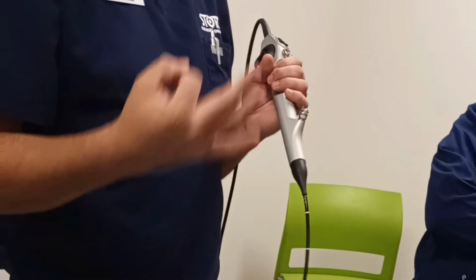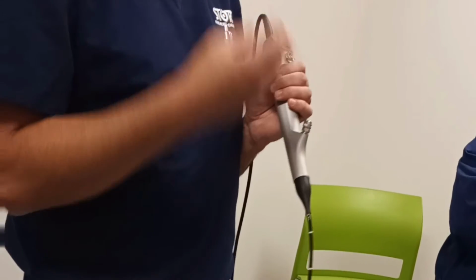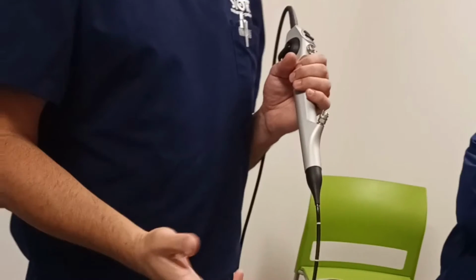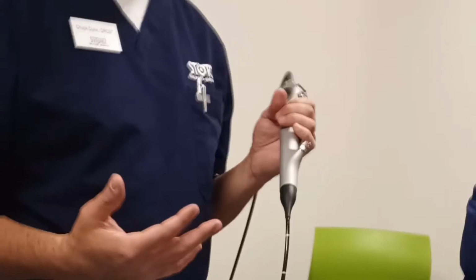So you're going to do a minimal of 3 times, but that doesn't necessarily mean you have to stop after 3 times. After your 3rd time, if you still see debris either being pushed out or pulled out, continue to do it until it's safe to continue the next step, right? All right, cool. Any questions about brushes?